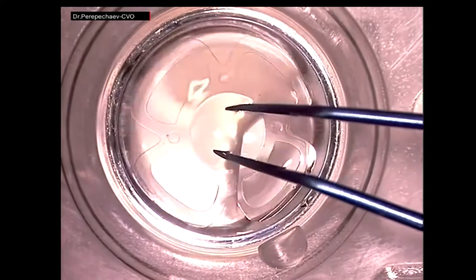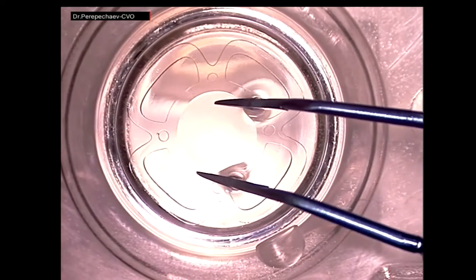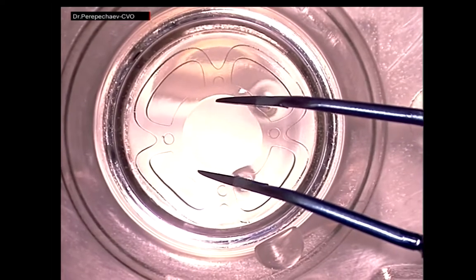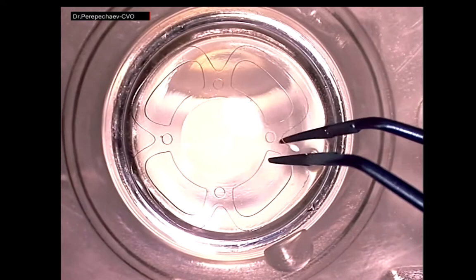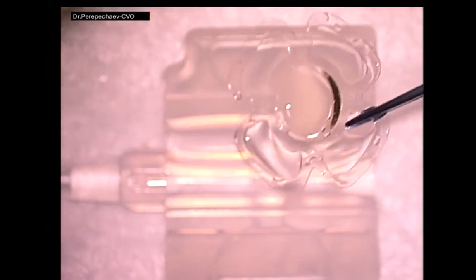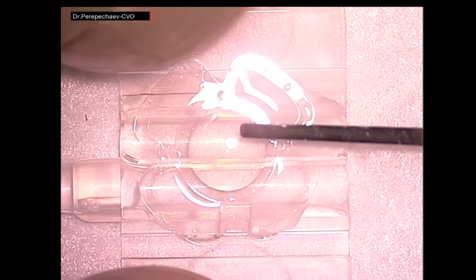After that, we pull the lens out of the solution using a micro tweezer. Important, the tweezers should be without teeth, so as not to scratch the optical part of the lens. We put the lens in the cartridge in the correct position, exactly as shown in the video. This is very important for the correct folding of the lens.